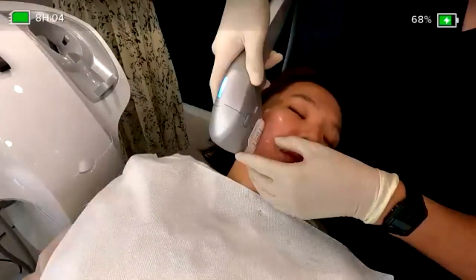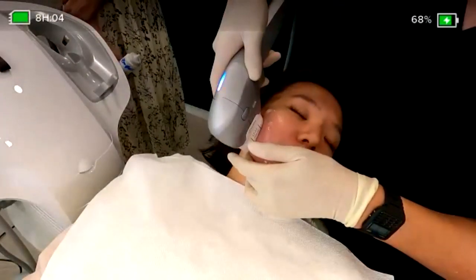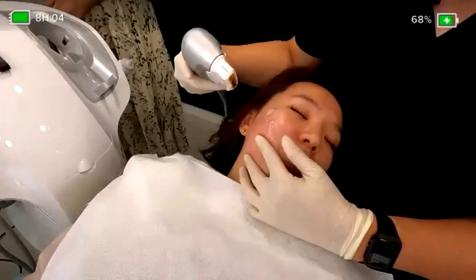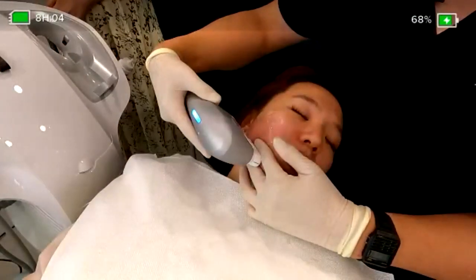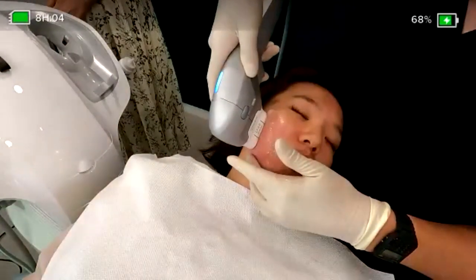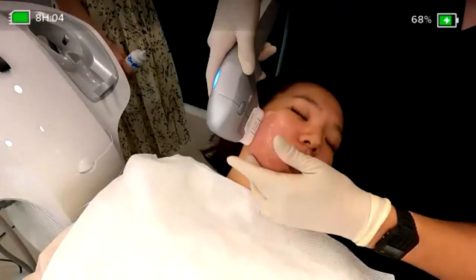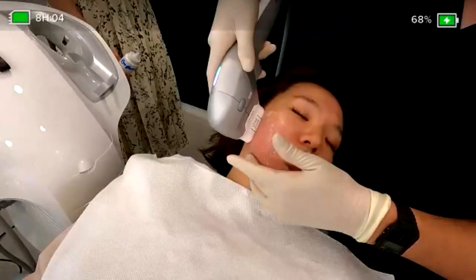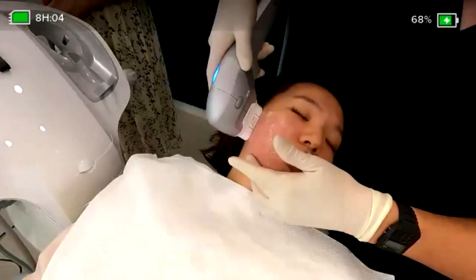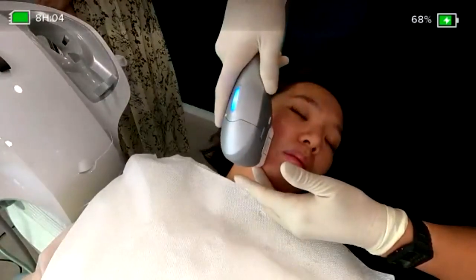There are many ways to approach the mandibular angles. If you want a sharper result, usually you can approach this angle and squeeze like that and make a pinching along the side like this, to protect the mandibular angles from any unwanted uncomfortable feeling for the patients when we are touching the periosteum. But if we are making firm contact, not pressing down too much, usually it is just it. Okay, already one pass. Going that way.